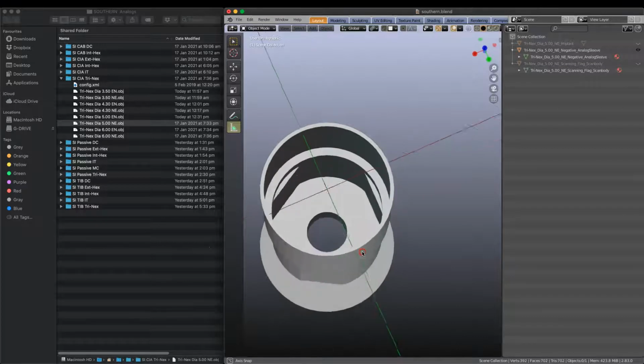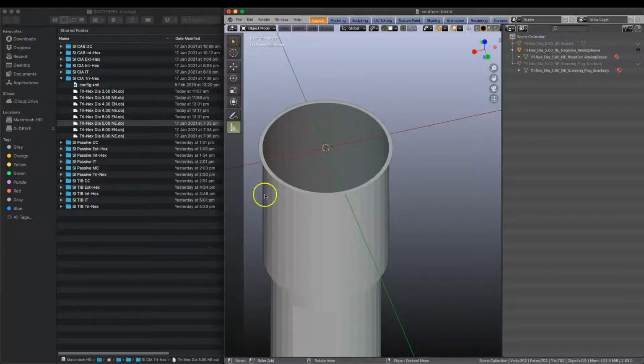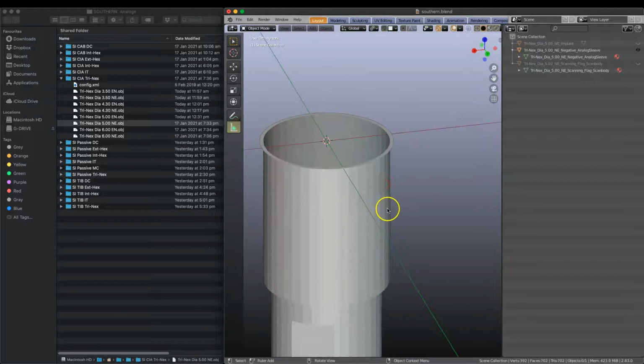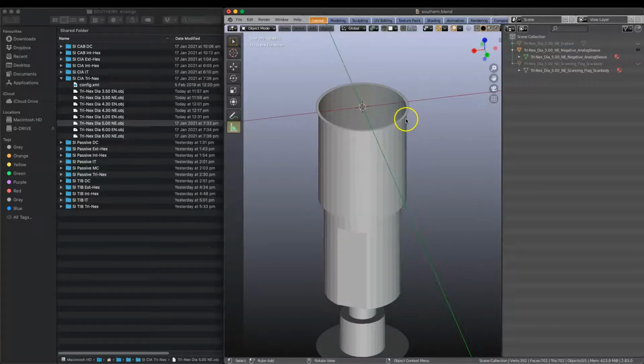Now with these components I like to keep a wall thickness of 0.7 millimeters. That is to make sure it will print out, and in case you want to use the Gum Designer module where you might choose to have a removable soft surrounding, like a gum kind of effect around the implant that's removable. If we have a wall thickness of 0.7, that will print and that will jut out of the model, and your gum component will just slide over that.